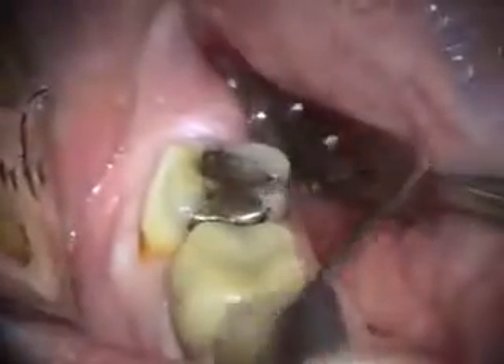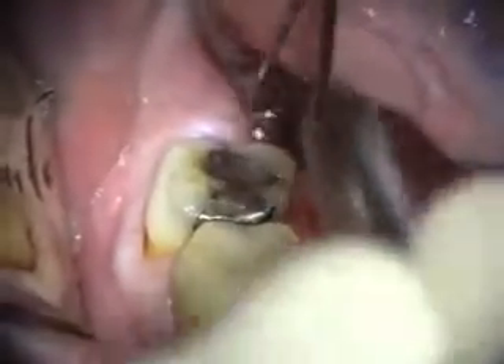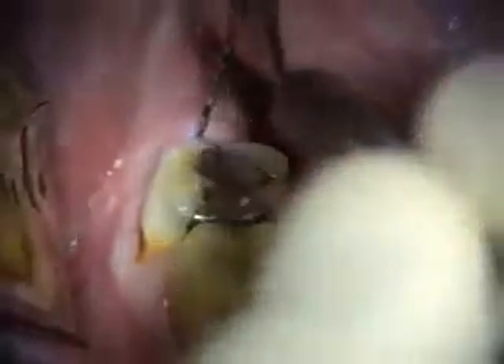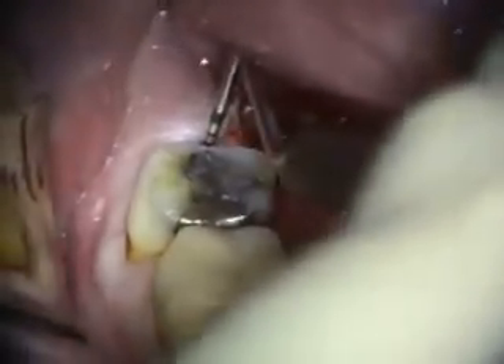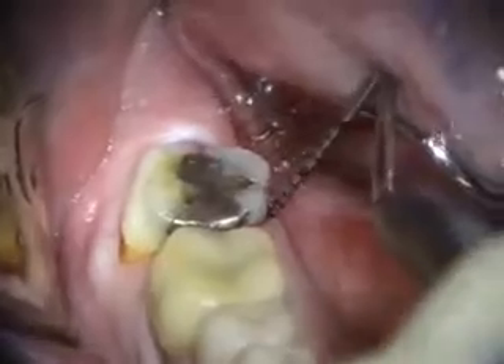Today we're moving to number 31. Number 31 has a fracture on the distal marginal ridge. You can see there's some pretty severe pocketing associated with it, and there's pocketing elsewhere around this too.